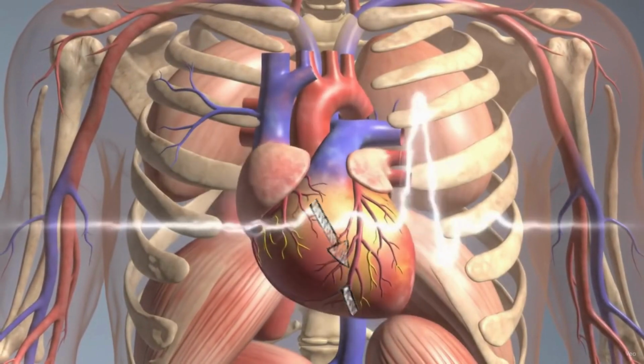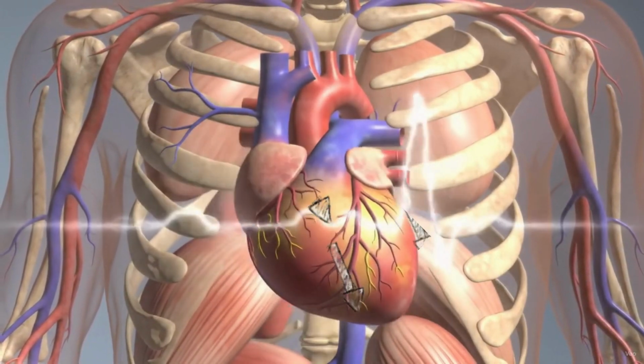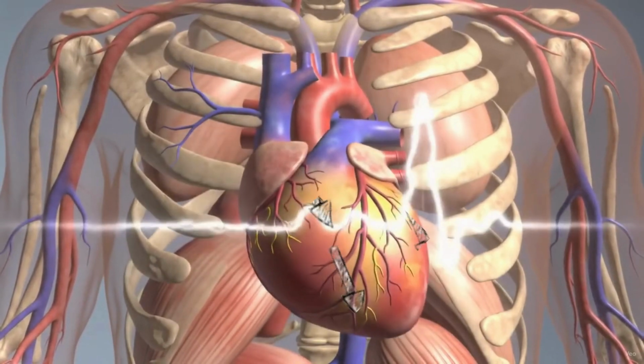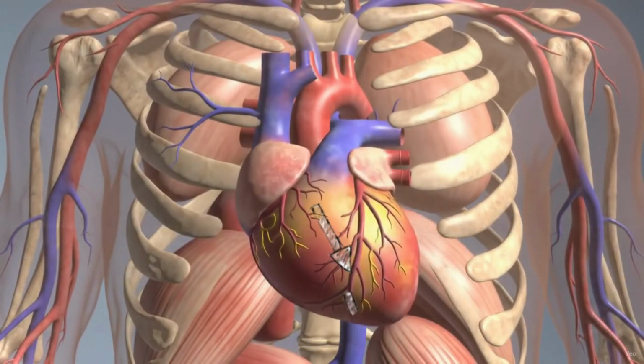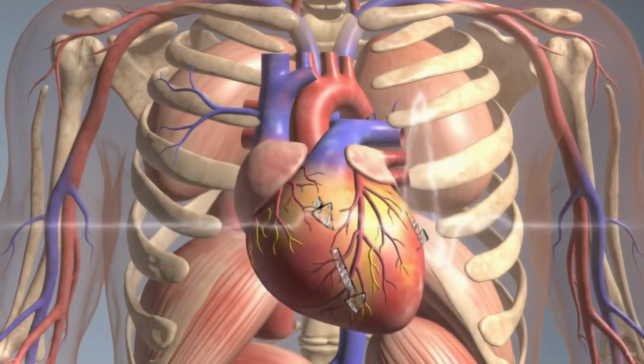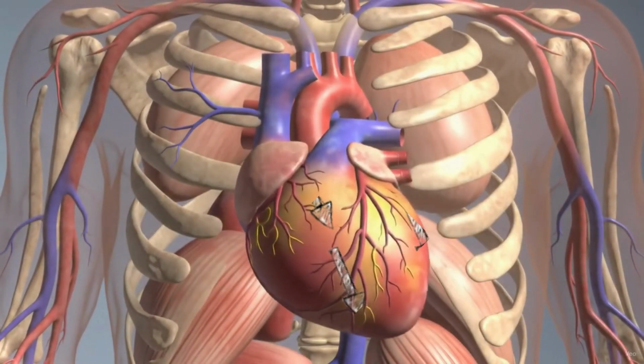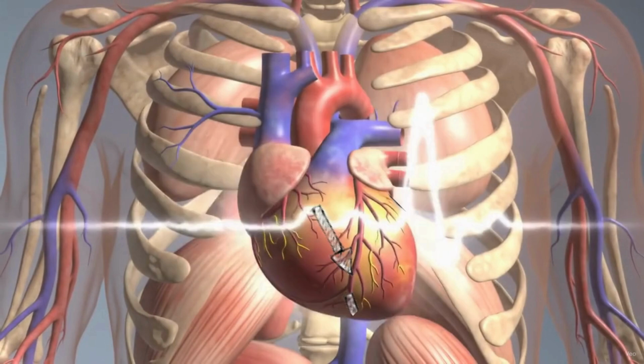Understanding ECGs through cardiac anatomy allows clinicians to precisely interpret the heart's electrical activity, linking waveforms to anatomical regions, and detect pathologies like infarction, hypertrophy, or conduction blocks by visualizing how impulses travel through and around the chambers of the heart.